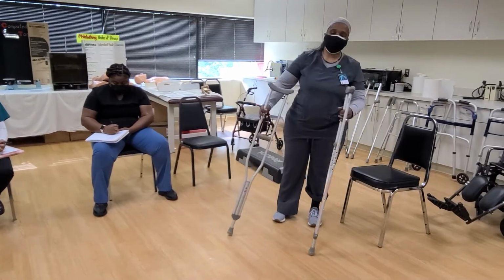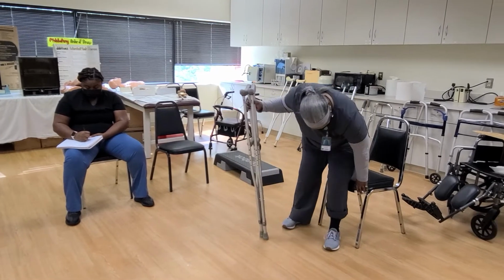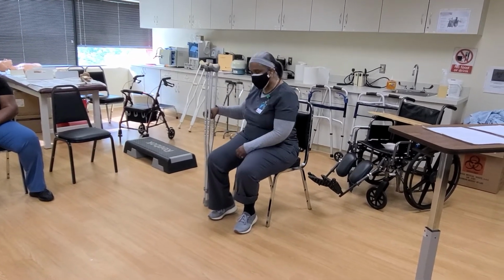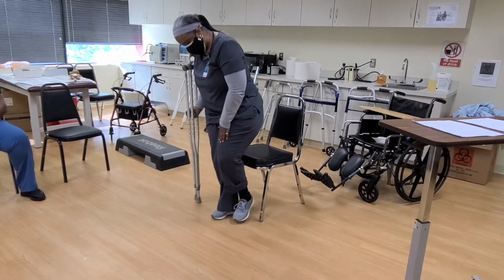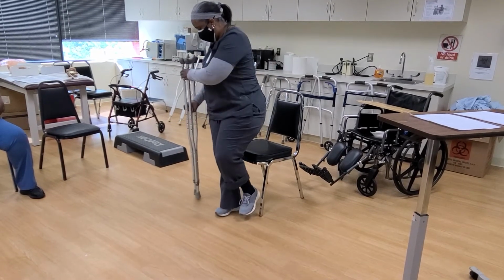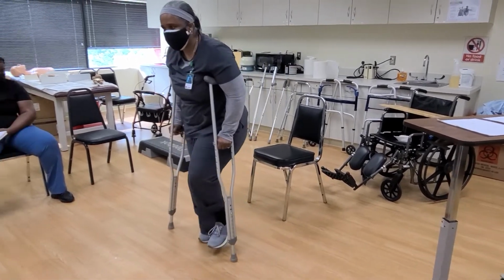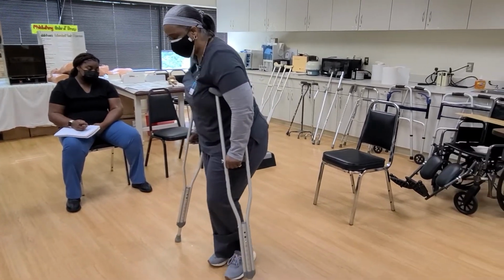When we are going from a seated to standing to ambulating position, I'm going to sit back like this and have both my crutches here. I usually put them together, and then I'm going to stand up. Again, I'm going to show you how I'm going to do it as non-weight bearing. Then I'm going to move one crutch to the other side, and I'm going to start to walk, okay?